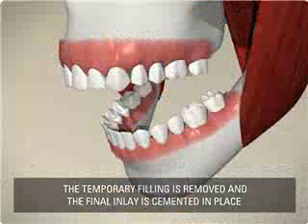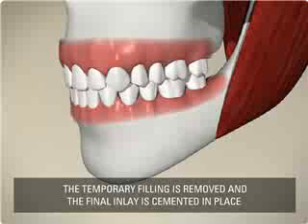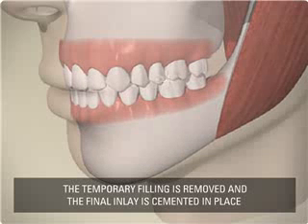When the inlay is ready, the temporary filling is removed and the inlay is cemented in place. Your dentist or hygienist will be able to answer any further questions you have about the procedure.